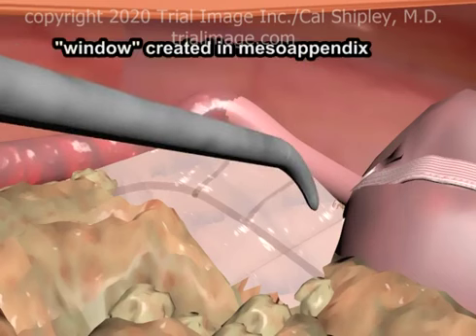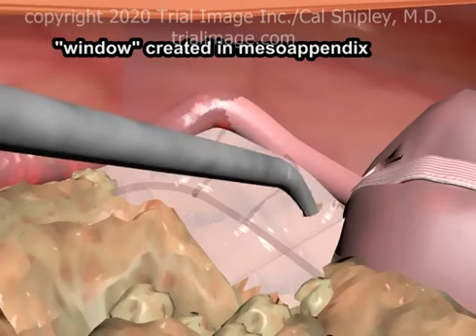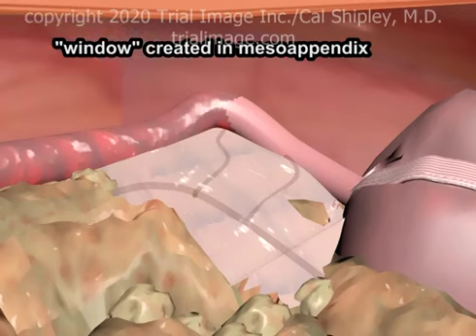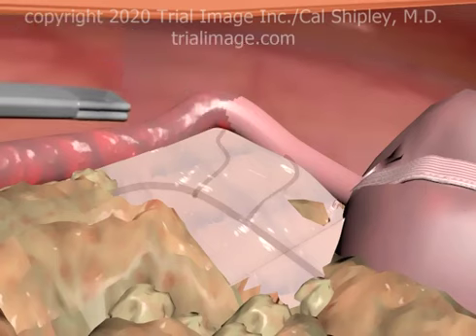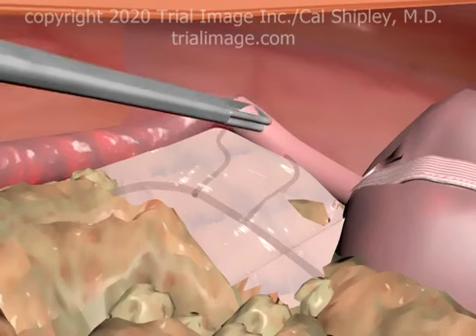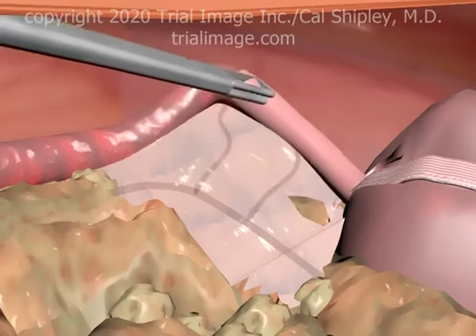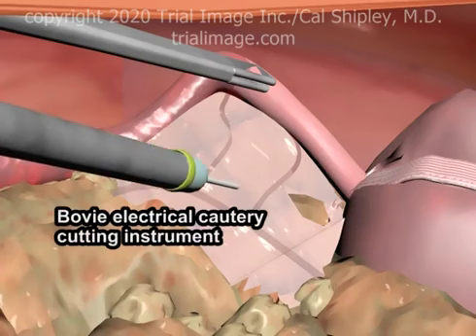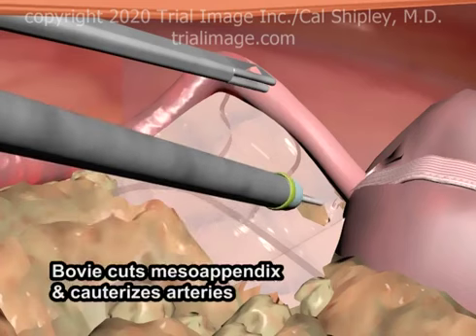Typically, a blunt instrument is used to create a window or hole in the mesoappendix membrane. A Bovie electrocautery unit is then used to cut the membrane, coagulating any vessels it encounters as it moves along.